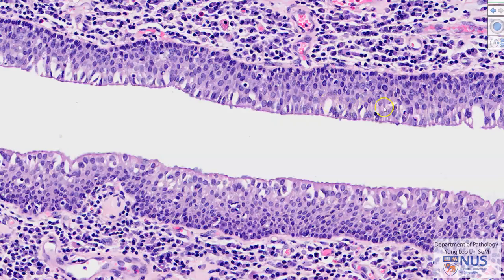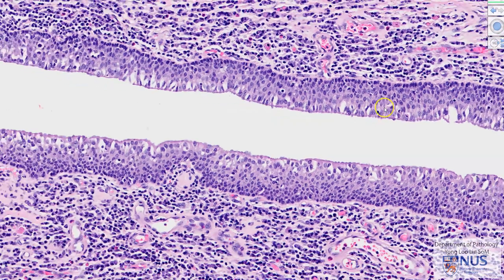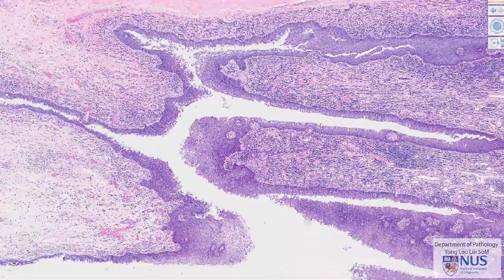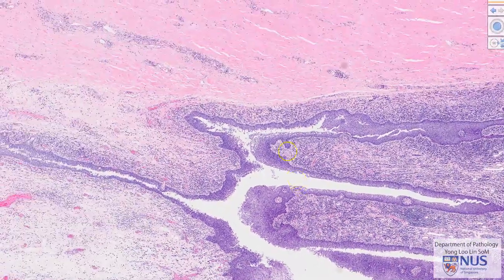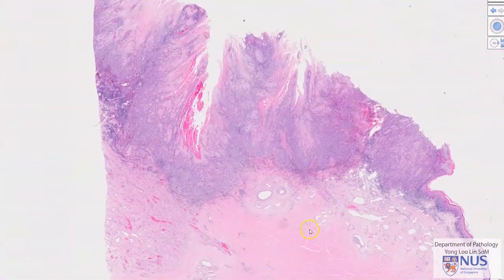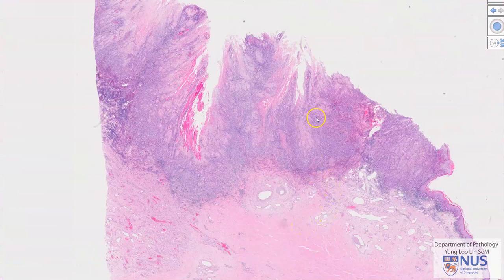Sometimes intraepithelial neoplasia, dysplasia, or carcinoma in situ can be seen in the penile urethra in cases of squamous cell carcinoma of the penis. Now let's take a closer look at the tumor itself. We can see that this is a mass that is relatively superficial.